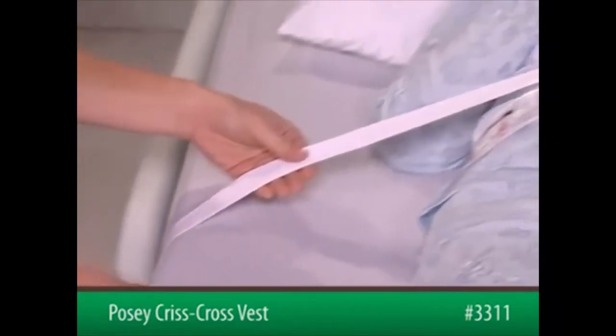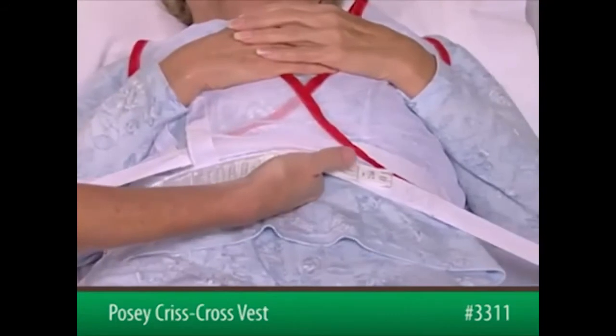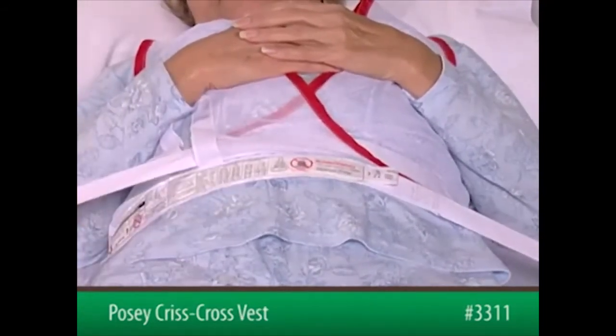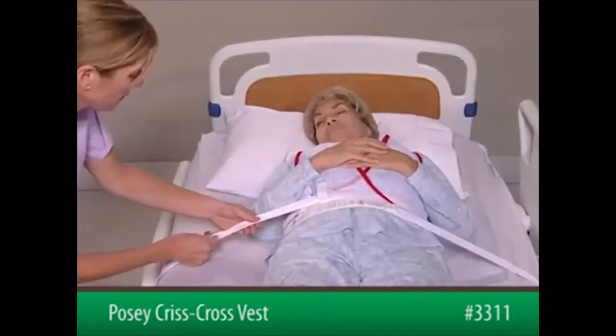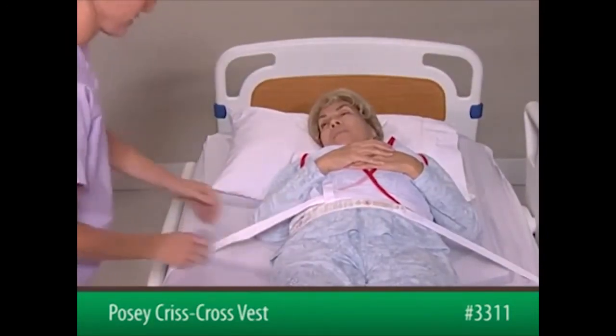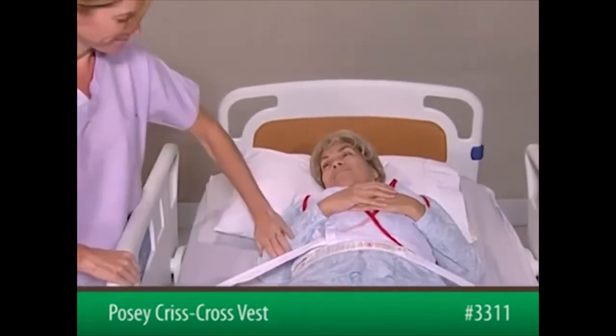After securing both sides to the bed frame, slide an open hand flat between the device and the patient to ensure proper fit. The device must be snug but not interfere with breathing. Check that the straps are secure and will not change position, loosen, or tighten if the patient pulls on them, or if the bed is adjusted.